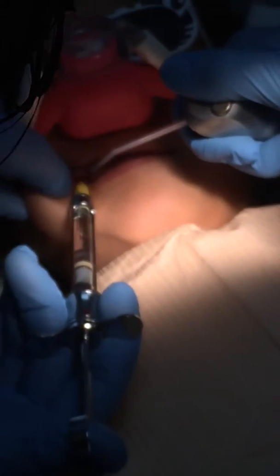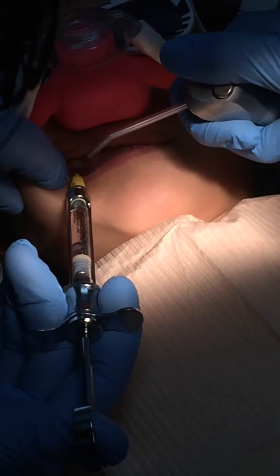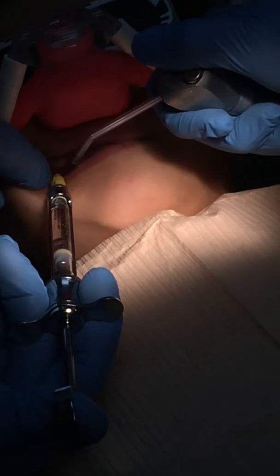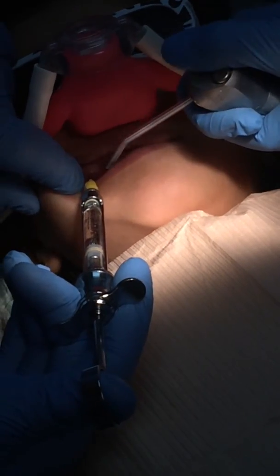Our standard of care is that we don't tell them they're going to feel any sort of discomfort — we don't use any of the keywords that can alert or alarm the child. You can say that they can feel ticklish: are you feeling ticklish?